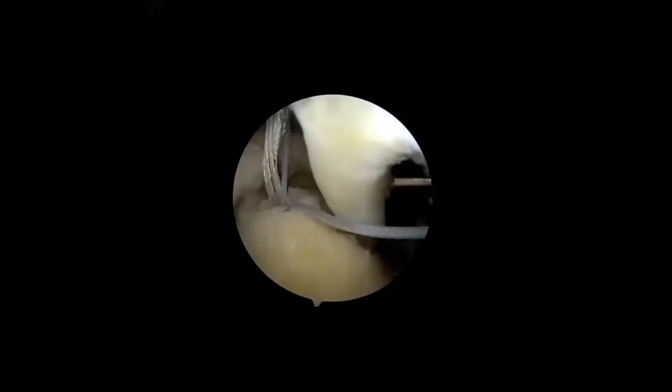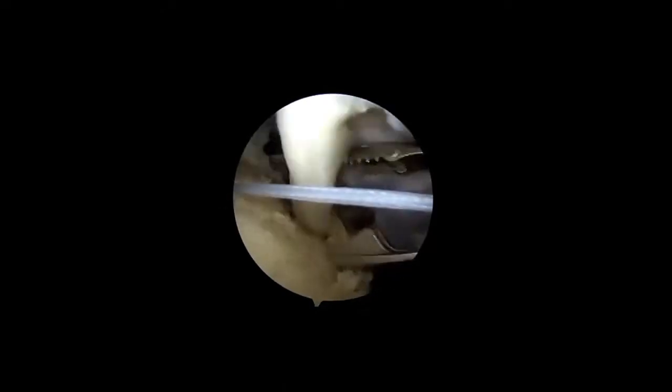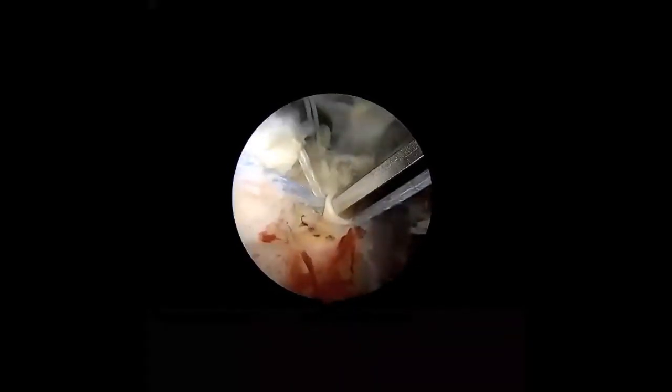An awl is used to create sockets for the suture anchors, placed at an angle of 45 degrees to the plane of the tuberosity. Starting with placing two medial triple-loaded suture anchors, the biceps tendon was placed under the rotator cuff tear medially. Anteriorly, sutures are retrieved individually and passed in a horizontal mattress using a suture passing device across the entire breadth of the tear.